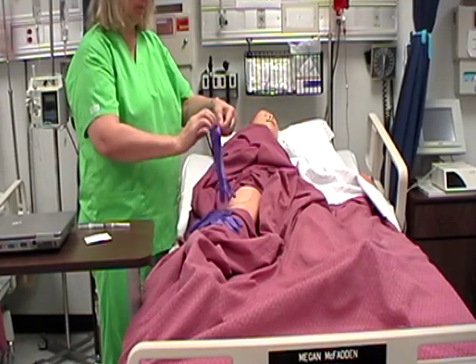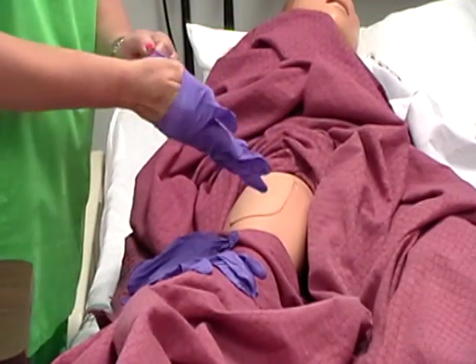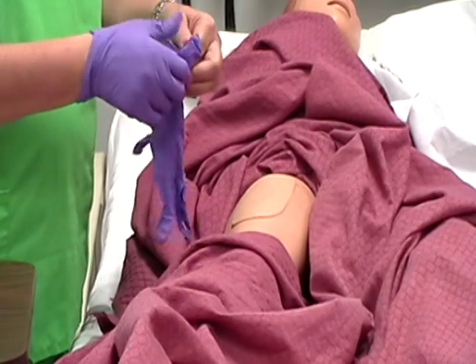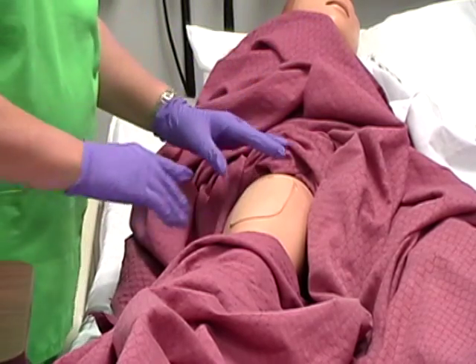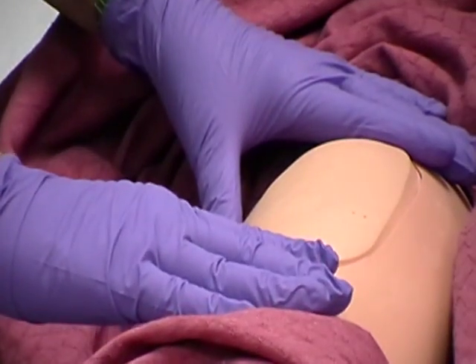Intramuscular Injection. Apply disposable gloves. Inspect skin surface of chosen injection site for bruises, inflammation, or edema.